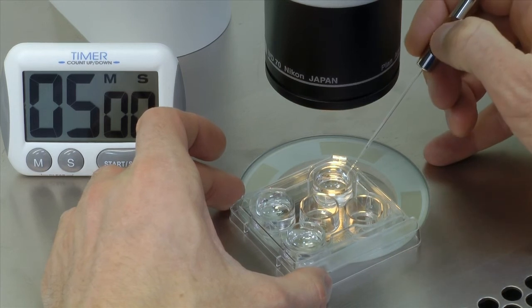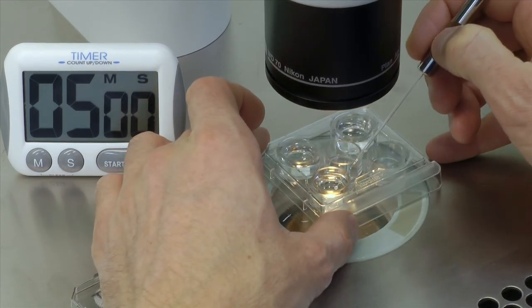Remove the embryos into equilibration solution 2 and expose for 5 minutes at ambient temperature.